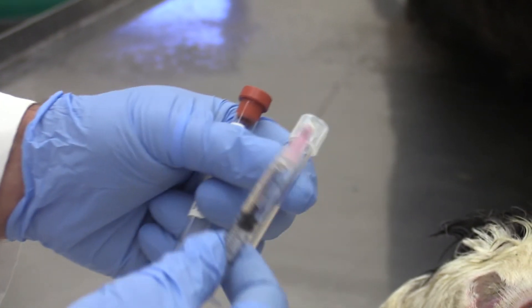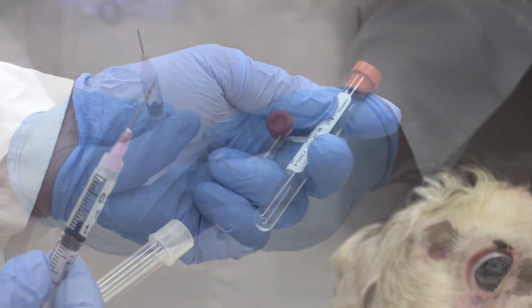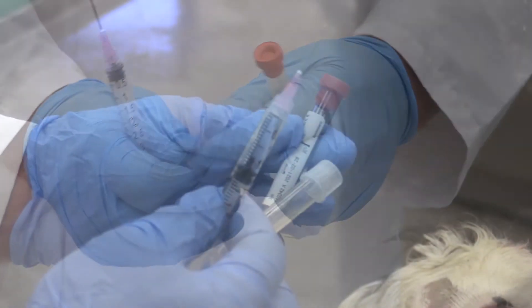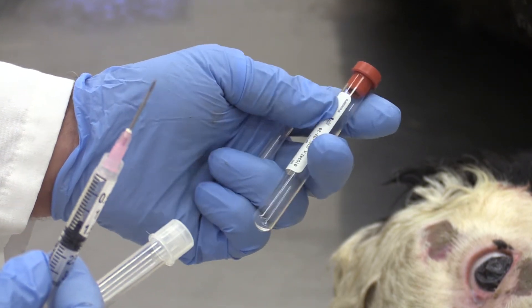Transfer the fluid into a snap-top or red-top tube. If you are going to sample for zinc, a snap-top tube is preferred, as the sealant on the red-top tube stopper contains zinc and will alter your result.